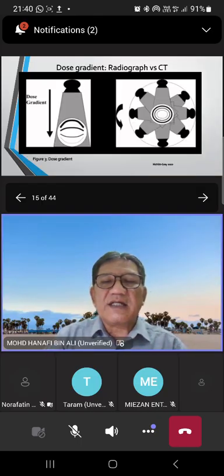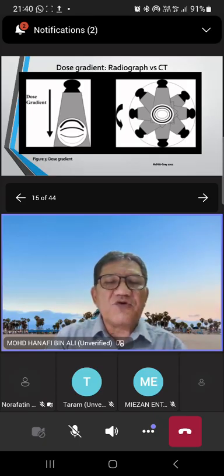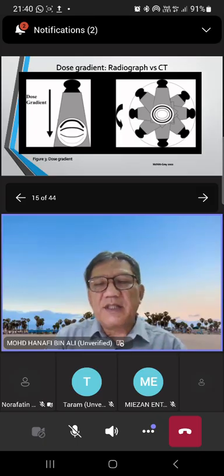This is where the X-ray CT scan is, and this is an X-ray. See the black there, that's a dose profile there, and lower here a little bit, because it is absorbed by a certain area in the human body here, or we call it the phantom there.